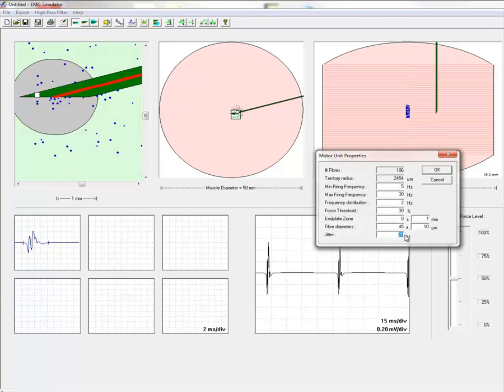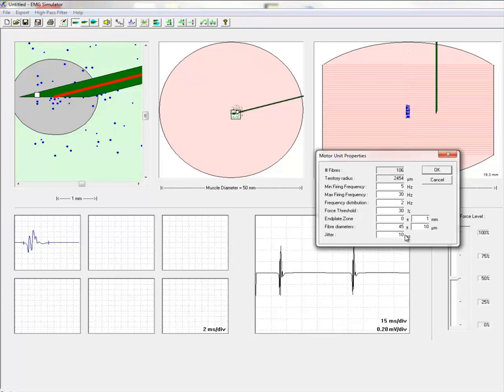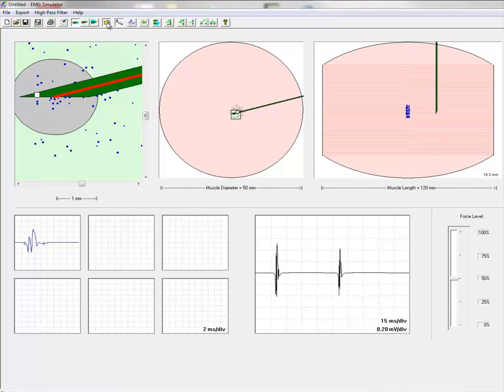If the jitter is set to even higher value, say 110 microseconds, then the instability is much more pronounced and individual spike components are missing.